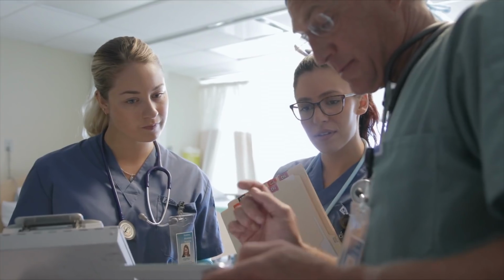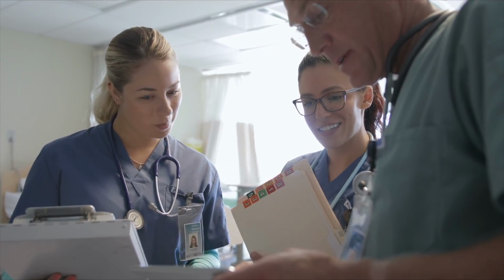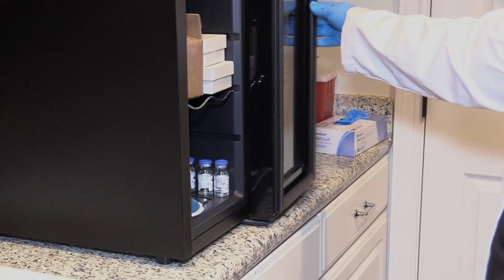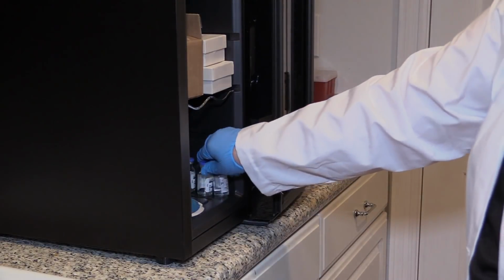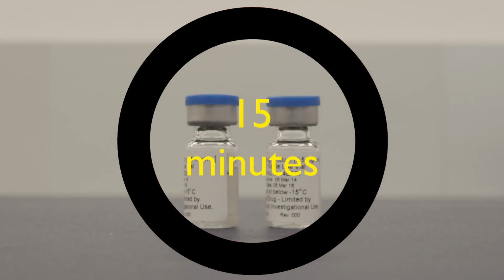On the day of treatment, the pharmacist or study coordinator will verify the plasmid calculations and remove the required number of vials from the freezer and document traceability. The vials should be placed on the countertop to thaw. This takes approximately 15 minutes.